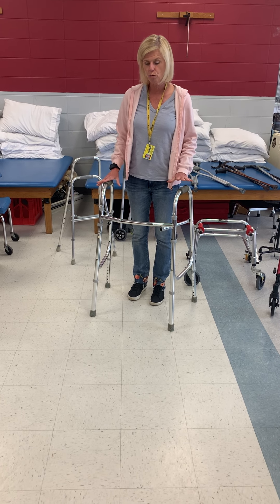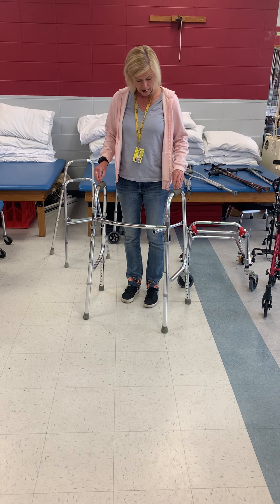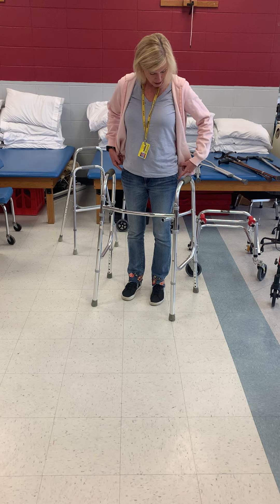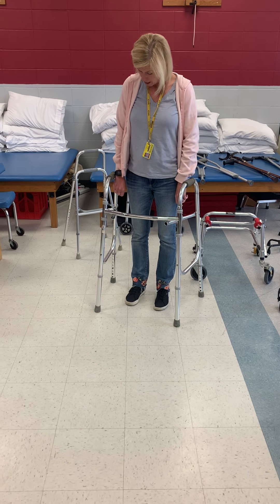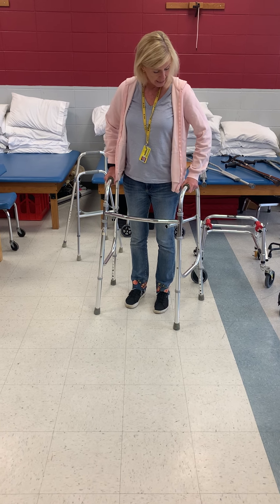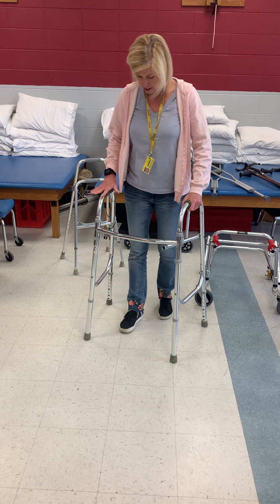Initially when we're first working with a patient with a walker, this is what we're going to use. You want the height to be set at about the greater trochanter or the ulnar styloid process, and you want the elbow to flex about 20 degrees. This is a standard walker.